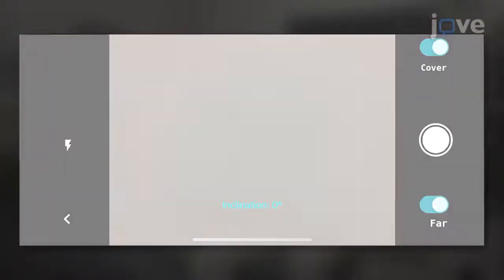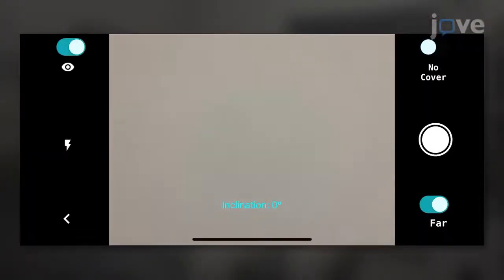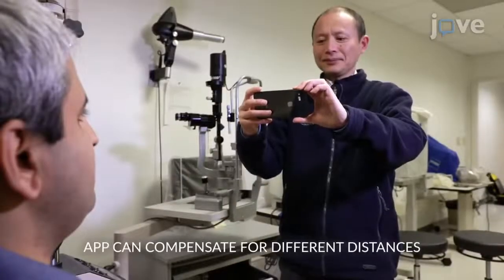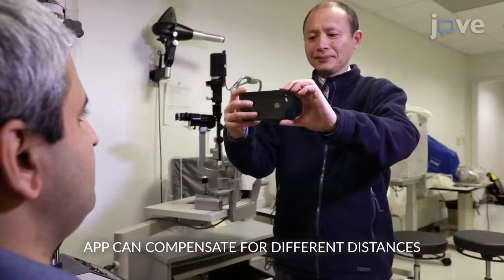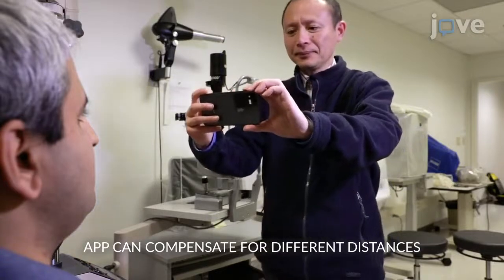To measure tropia with a single snapshot with a near fixation, launch the app and set the mode to No Cover. Select Near and position the phone in a landscape orientation about 40 cm from the patient at eye level, with the rear camera facing the patient.